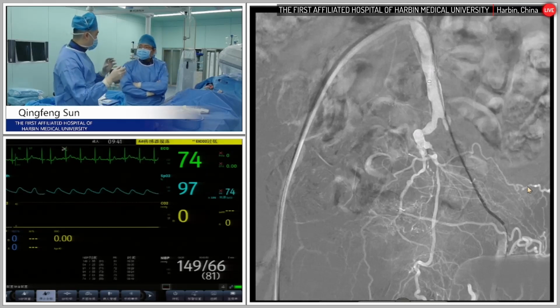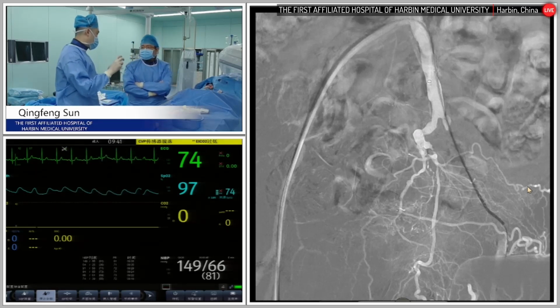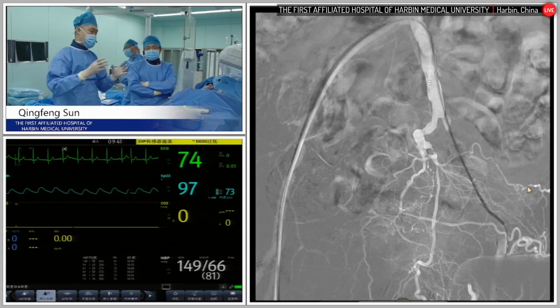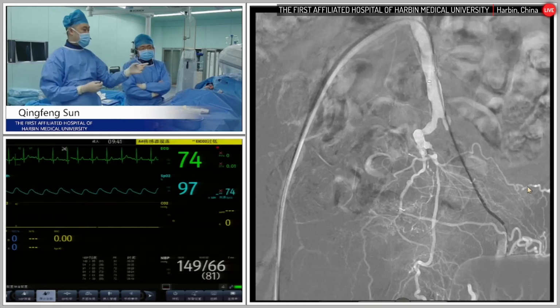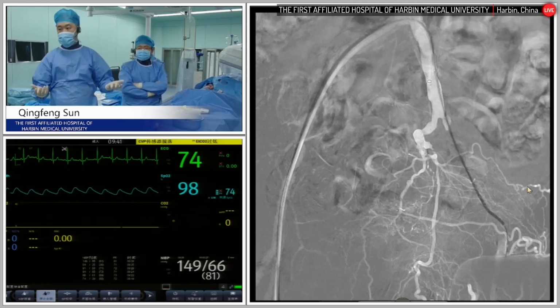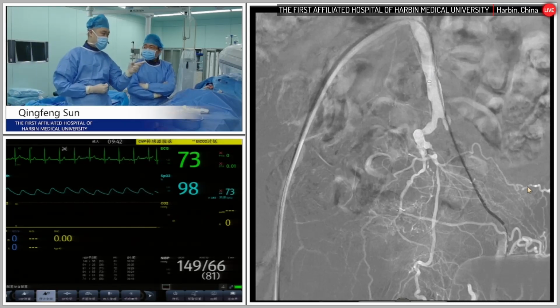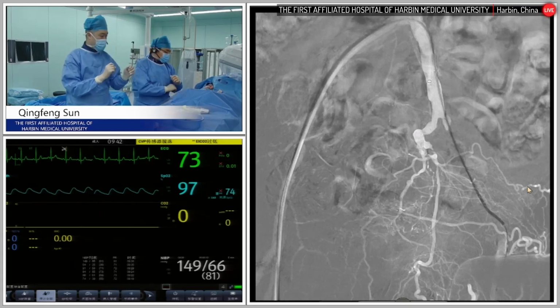You have to decide carefully. You have to see it's very accurate and make your final decision to either do DCB or use a stent, or actually just the debulking is good enough. So I think basically Dr. Sun's meaning is it all depends on patency. For these patients, probably after we put in the Viabahn here, he can last for a really long time, even if you don't use the IVUS. But if we successfully pass the disease in the SFA, we definitely should use IVUS to see the actual situation in there, right?